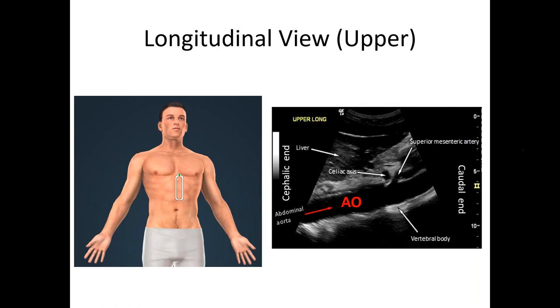We also have to get the corresponding long axis or mid-long axis view through the middle of the abdominal aorta. How we know it's when we sweep the probe side to side along the aorta, we will notice that you will start seeing the intima and the media adventitia. When you see that, then clearly that is going to be your mid level, because that's when you'll be able to see these layers of the wall of the aorta very clearly.